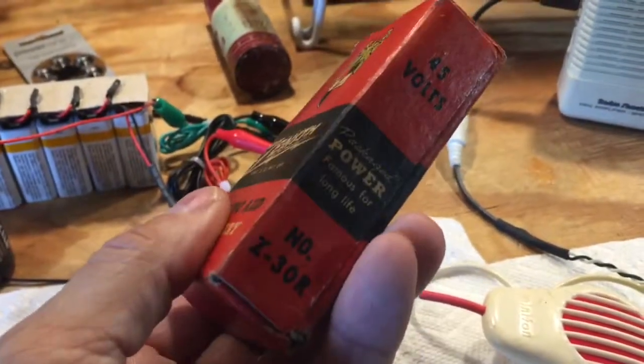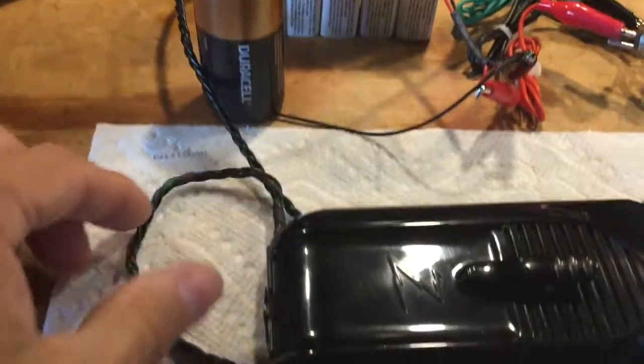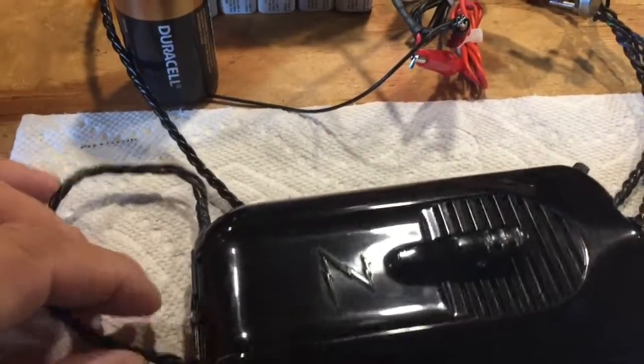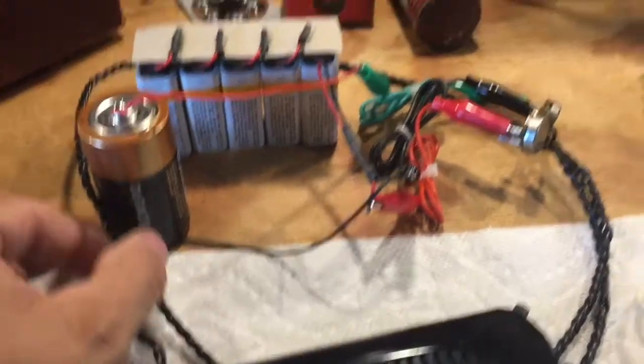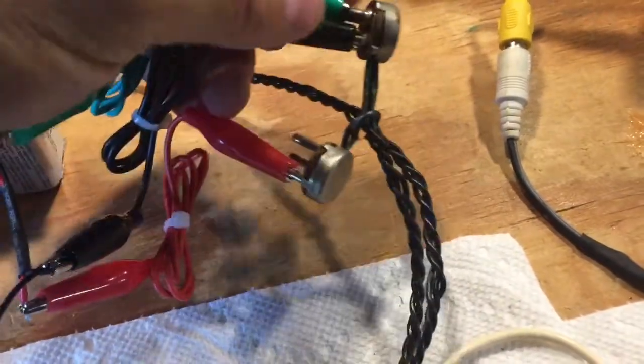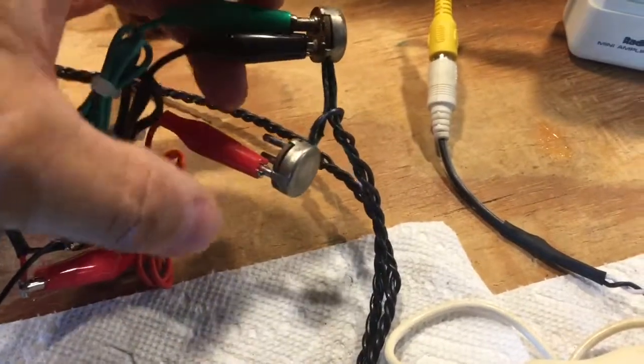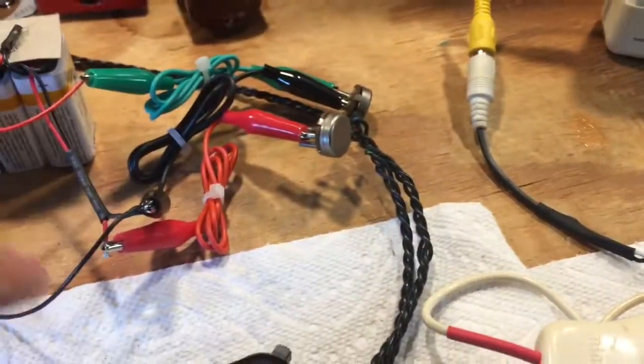This 45-volt battery pack is no longer available — hasn't been for many years. You can see the original plug connection on it. The original battery supply wire was completely ruined, so I made a new one: a three-conductor twisted wire battery cable with the original connectors put back on, wired into the original plug.